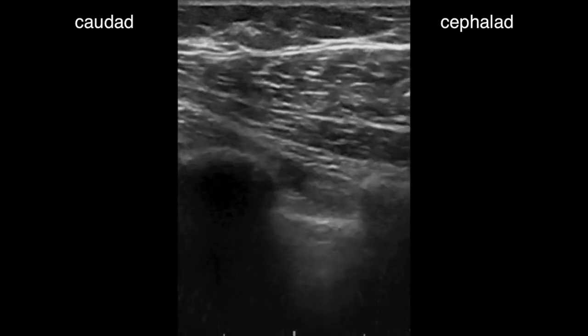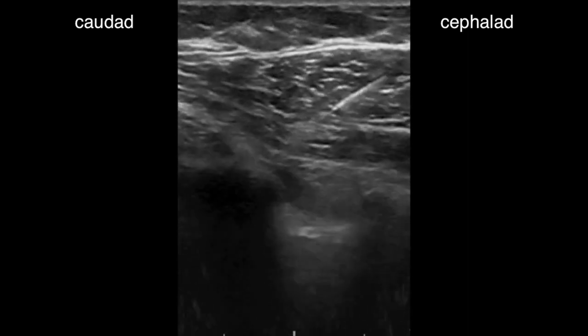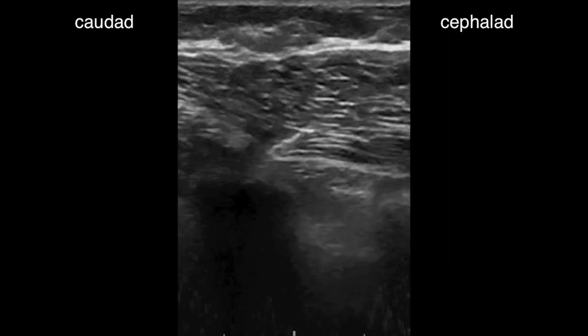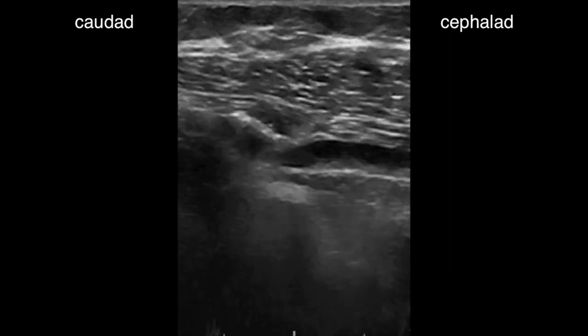Moving down a few centimeters, we now see the fourth rib, the two PEC muscles, and the serratus anterior muscle. The needle passes through both PEC muscles and then finds the fascial plane. You can see the two layers unzippering here nicely. This requires slightly more volume, and we find that 20 mL does the job nicely.